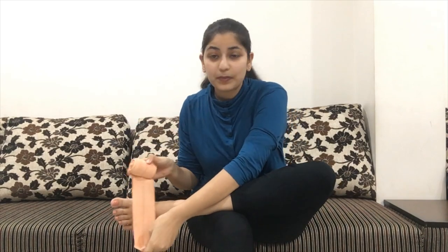Like we were discussing, agar aap apne kisi friend ya family ke liye yeh baandhna chahte hain, ya even for yourself, you should know how to wrap this up. Yeh elastic wrap jo mere paas mein hai, isko hum hold kaise karenge pehle yeh dekh lete hain. Isko kabhi bhi tie ya wrap karte waqt aise rakhna hai, aur na ki isko ulta position mein. Because otherwise, yahan se roll out hote waqt dahi nahi lagti hai, and then it becomes out of control. Which is why we always roll it up this way.